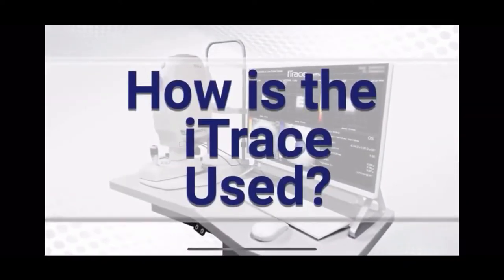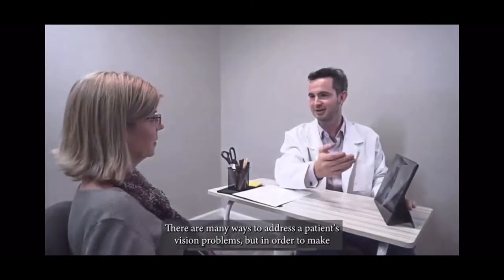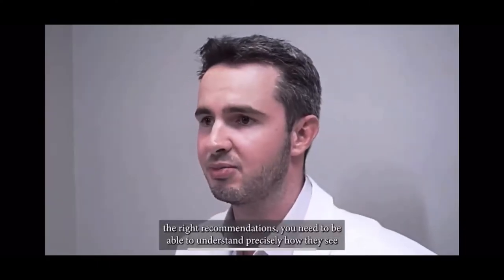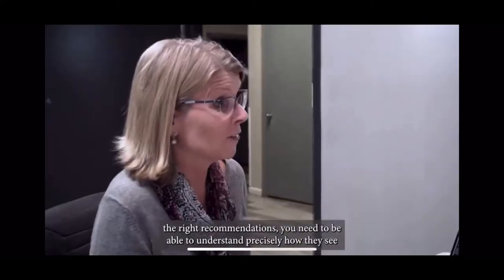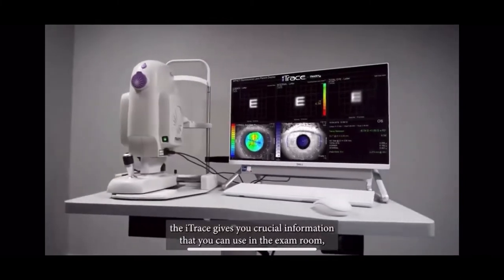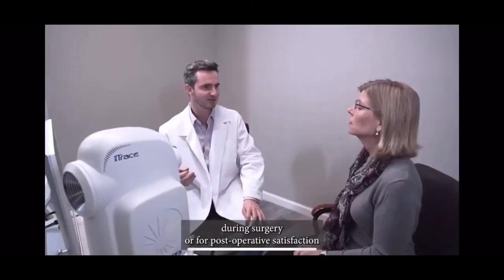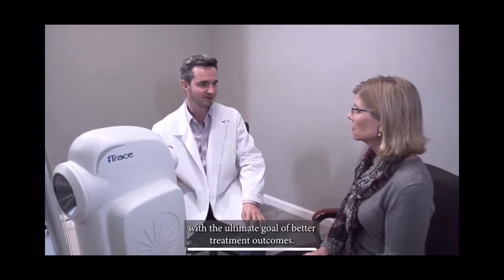How is the iTrace used? There are many ways to address a patient's vision problems, but in order to make the right recommendations, you need to be able to understand precisely how they see. The iTrace gives you crucial information that you can use in the exam room, during surgery, or for postoperative satisfaction with the ultimate goal of better treatment outcomes.